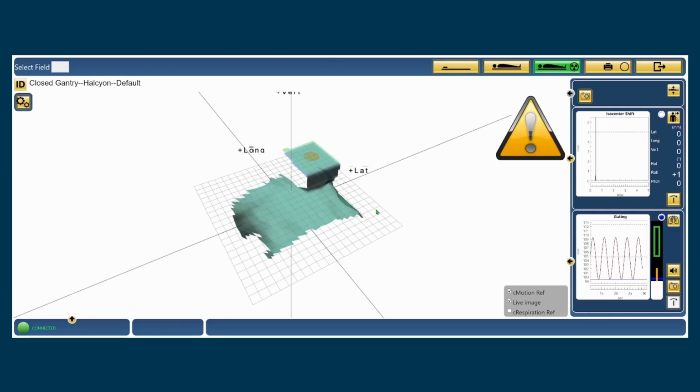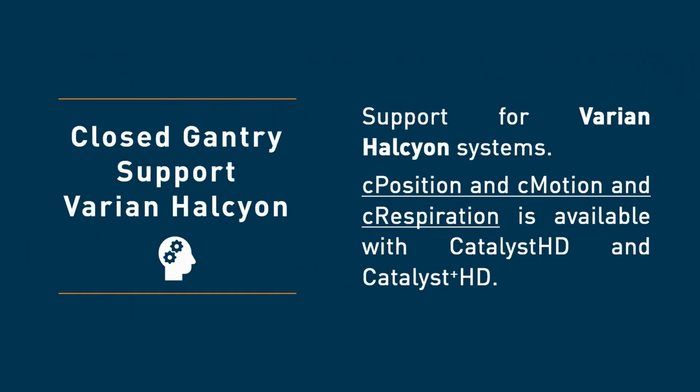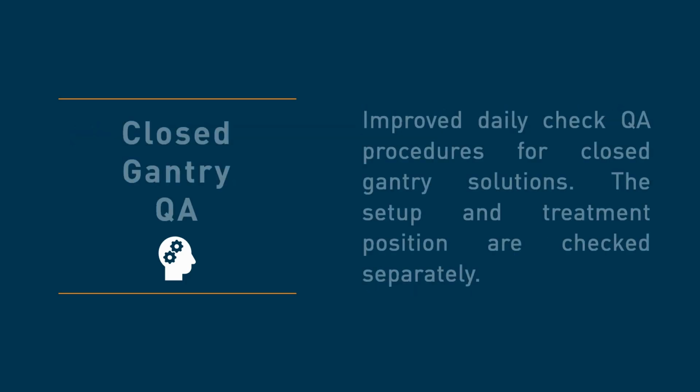The setup position uses a combined surface image from all three Catalyst units. The treatment position, however, is managed only by the middle Catalyst unit. When switching to the treatment mode, you are asked to move the couch by the longitudinal offset before proceeding with the workflow. And finally, we have also improved our QA procedures for closed gantry systems.